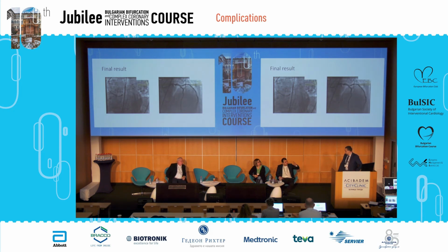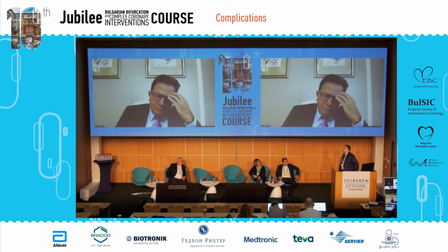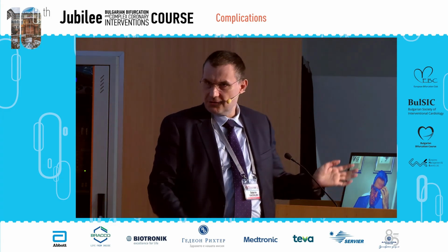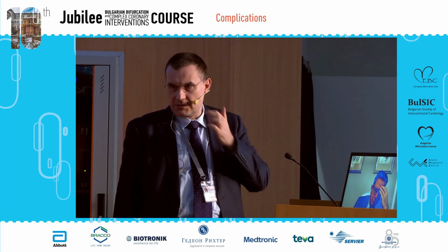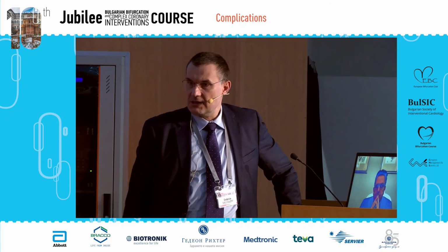What was the size of the left main? Because we saw a huge aneurysm. Yes, but the aneurysm was actually at the tip, like a neuro aneurysm at the tip of the carina. So after stenting, it was almost closed. The size of the aneurysm at the end of the procedure almost disappeared. So actually, the stent pushed the carina and closed the aneurysm.